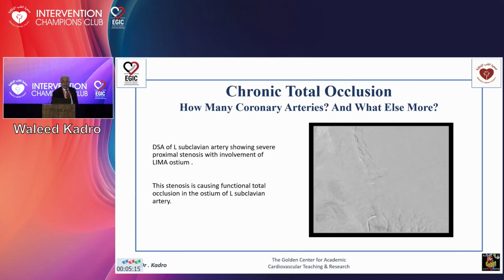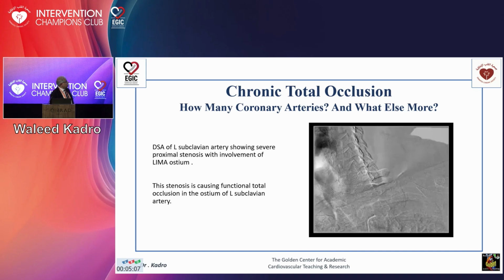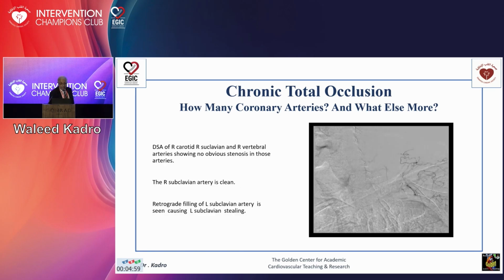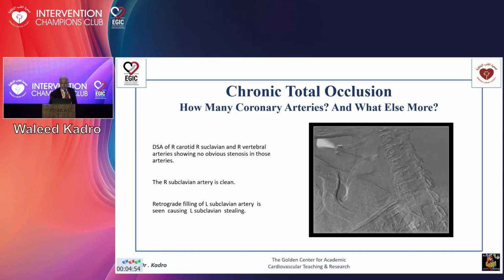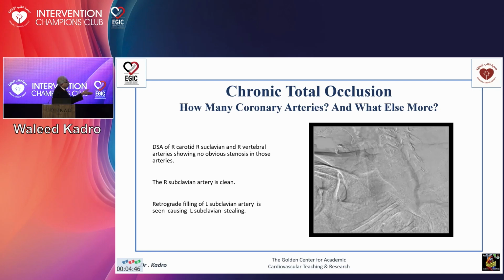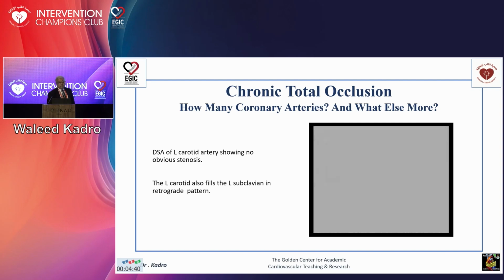So this is the angiogram for his subclavian. You see severe stenosis in the left subclavian involving the origin of the vertebral and the LIMA. Even with this lesion, you can't use the LIMA. And this is the angiogram on the other side, the right subclavian. And you see the carotid is okay, but you see filling retrograde of the left vertebral. That's called subclavian steal syndrome. And this is his carotid on the left side, which is normal.